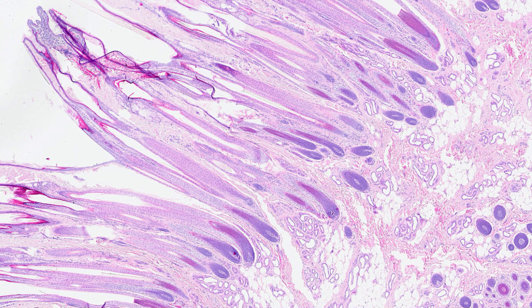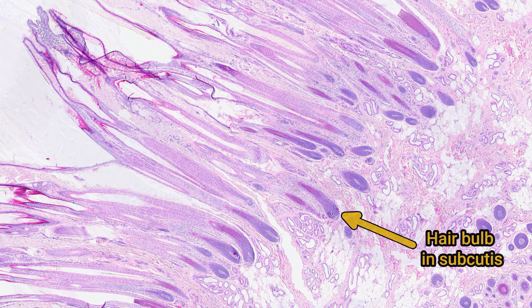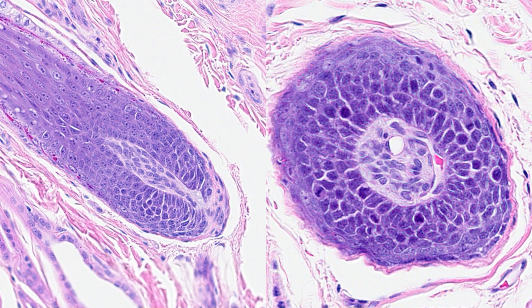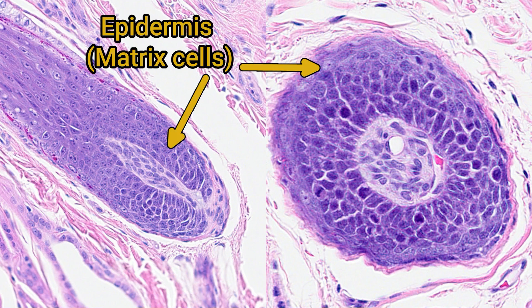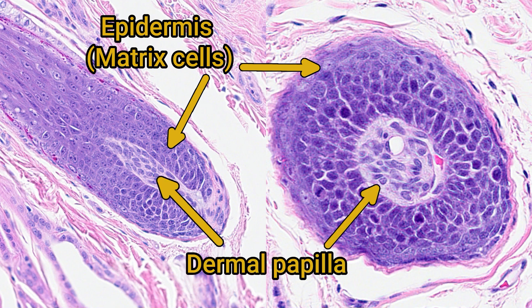During anagen, the hair follicle extends into the deep dermis and sometimes into the subcutis. Right at the base of the follicle there is the hair bulb, made up of an epidermal component wrapped around some mesenchymal cells — the dermal papilla. The cells here play an important role in regulating hair growth, with the vascular connective tissue supplying nutrients and oxygen to the dividing epidermal cells.